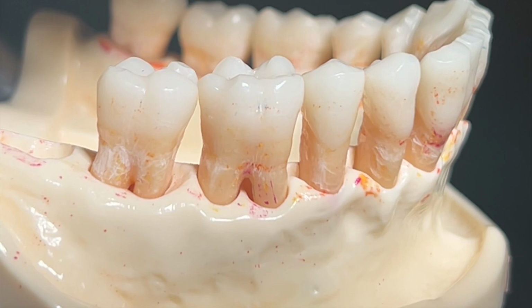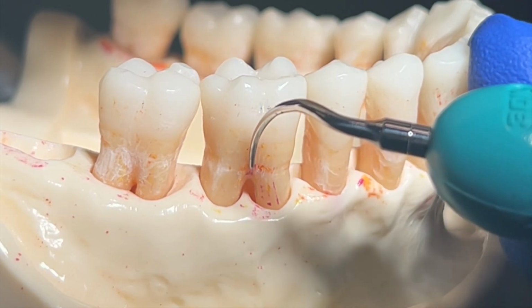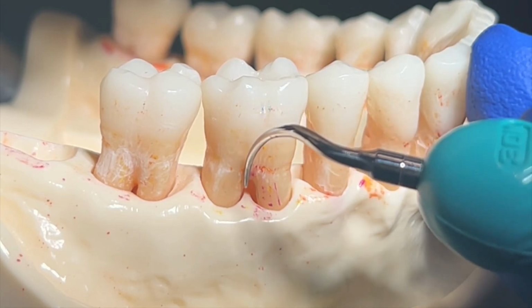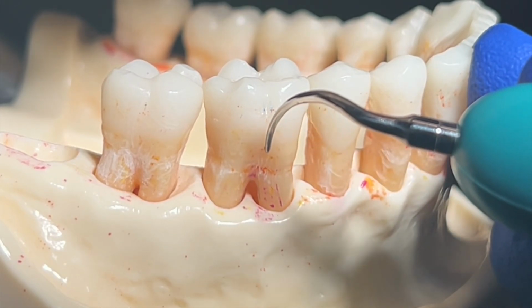The primary use of the left and right insert is known as the vertical technique. The vertical technique is indicated for periodontally involved patients that present with pockets that are 4 millimeters or greater, areas with clinical attachment loss, and furcation involvement. The handle is roughly parallel to the occlusal plane.